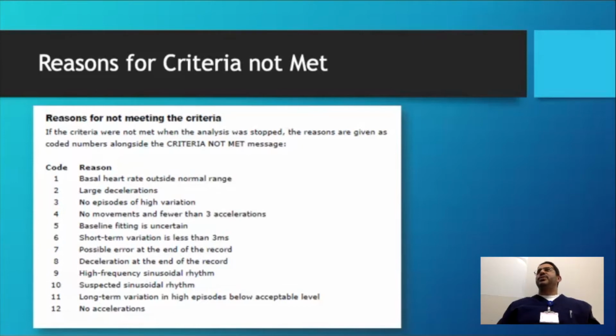So if you want to get an induction of labor going, then Dawes Redmond is definitely going to help you because it's going to show, yeah, that baby's active, it's fine, carry on. Or no, that baby is asleep, wait for it a little bit longer. Okay? Does that make sense? So here it's very helpful.